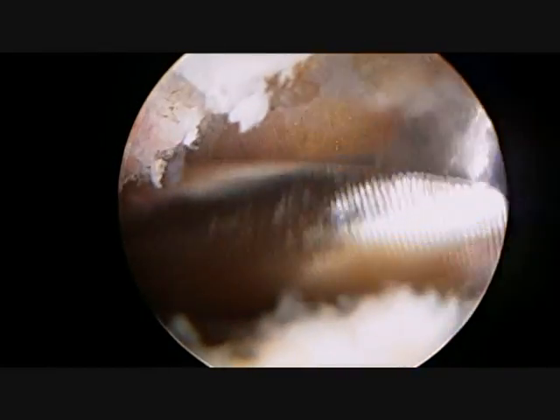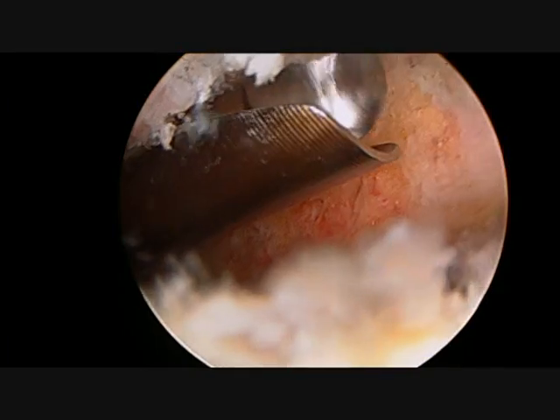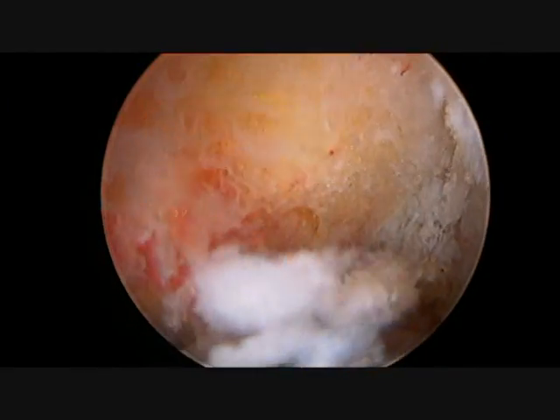Once all the bone has been removed and a large enough space has been created, the arthroscope is inserted through the front of the shoulder to allow visualization of the entire resected joint to assure a complete resection.